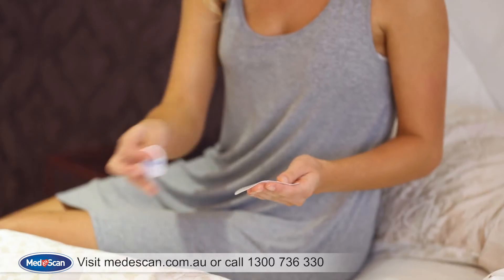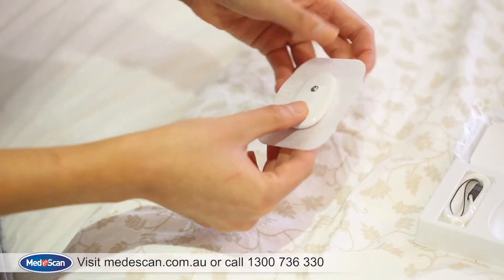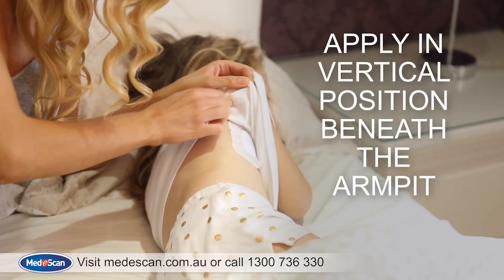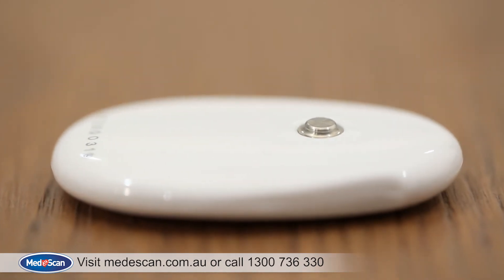Use the adhesive tape provided to attach the SmartScan thermometer to the patient. Apply the adhesive tape on the MediScan logo side of the SmartScan thermometer. Now apply the SmartScan thermometer in a vertical position beneath the armpit, making sure the silver sensor makes good contact with the skin.